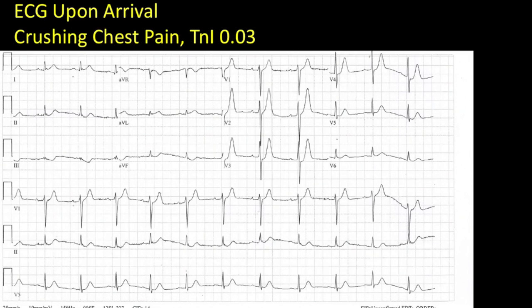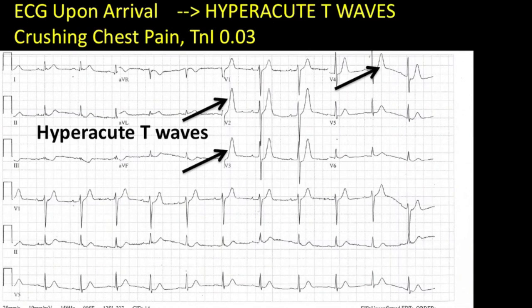And here's the initial EKG. What do we see? We see tall T-waves — very symmetric. They're not as pointed or tented as the ones you'd see with hyperkalemia, but you're going to want to rule that out also. So these are hyperacute T-waves, and they're seen here in the anterior leads, especially V2 through V4, maybe even V1.